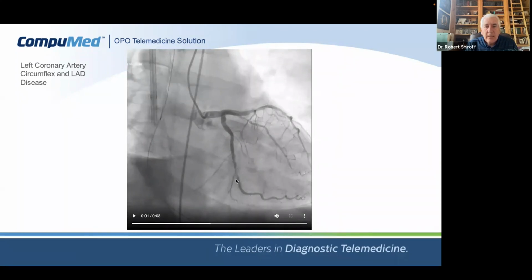Here you can see what looks like a narrowing to my eyeball, comparing the thickness of the wall here versus the thickness of it here, the diameter of it. And up here is of concern to me, and I can't tell about up here, although it looks a little broader than this does.